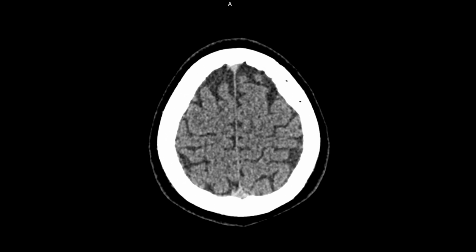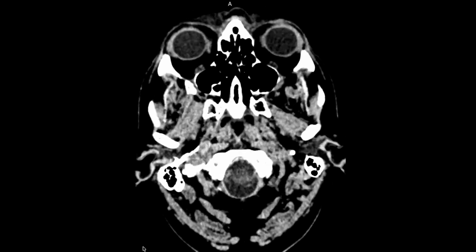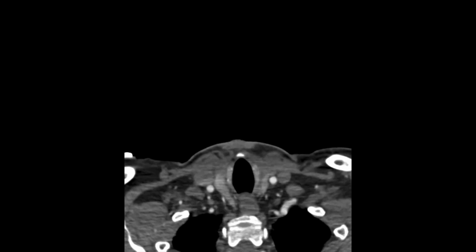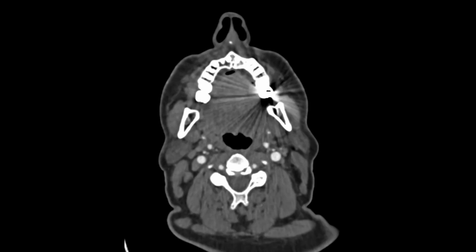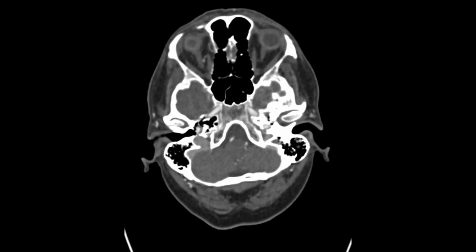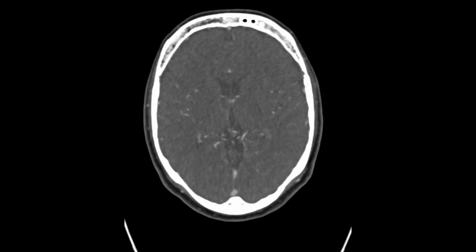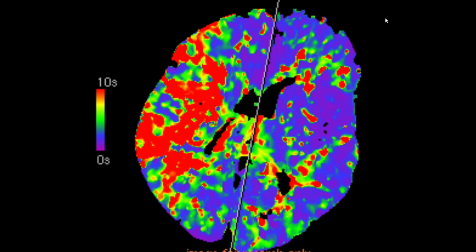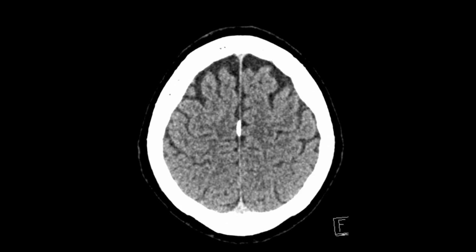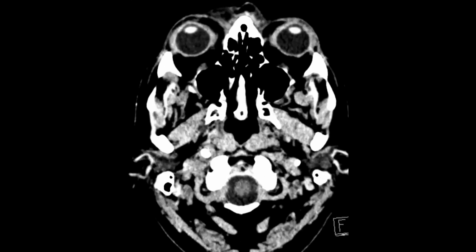And back to our patient, this is the pre-interventional non-enhanced CT of the brain with no evidence of infarction. And this is the CT angiogram, and as you can see, the right ICA is very narrow at the distal parts of the C1 segment, but it is contrasted in the intracranial segments with no intracranial occlusions. And in the time to drain of the CT perfusion, we can see a large perfusion deficit on the right side. And here we have the post-interventional CT of the brain, and as we can see, there are no complications, no hemorrhage, no infarction. And here we go.